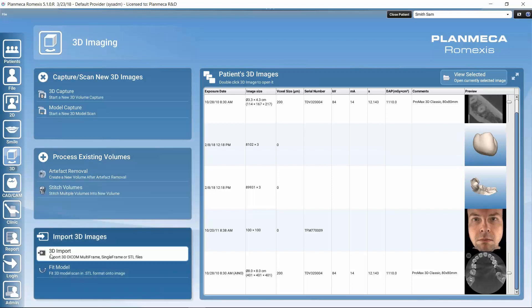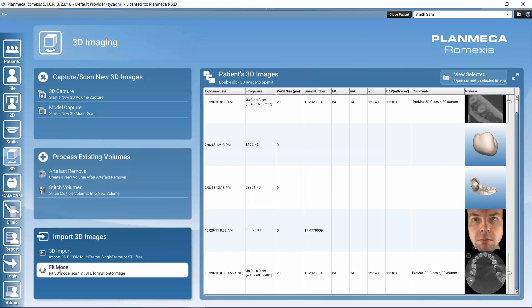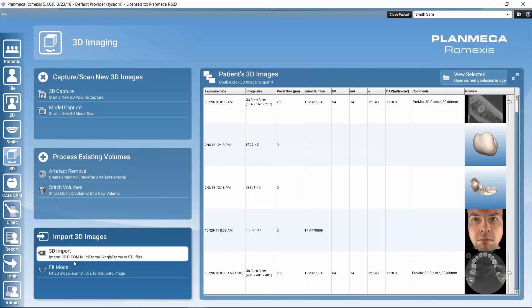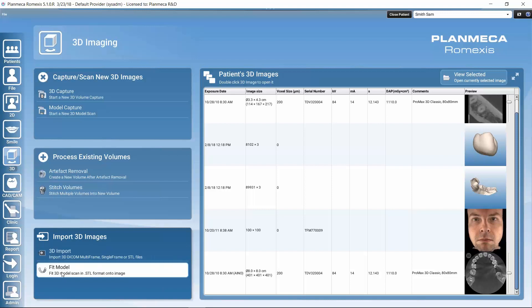We can also import new images for the patient. For example, if you have another manufacturer's 3D imaging unit and we have data in DICOM format, we can import that into RomeXis — it is an open system. And if we would like to fit an STL to a volume, we could use this function here. We can also find this function inside the submodules of 3D imaging modules once we have a 3D volume opened.